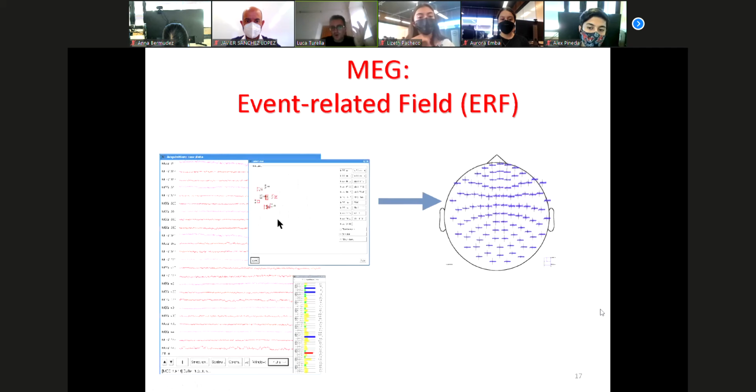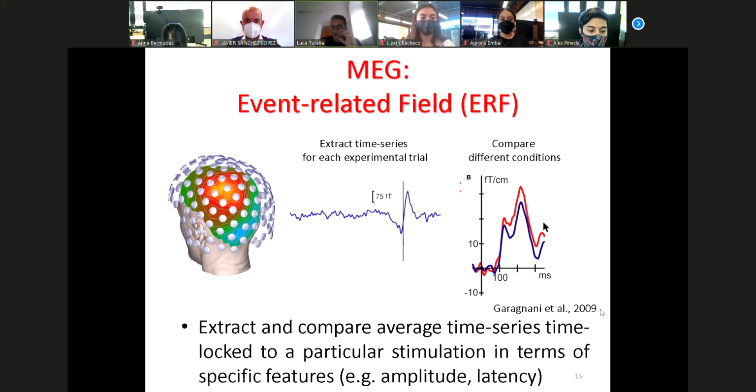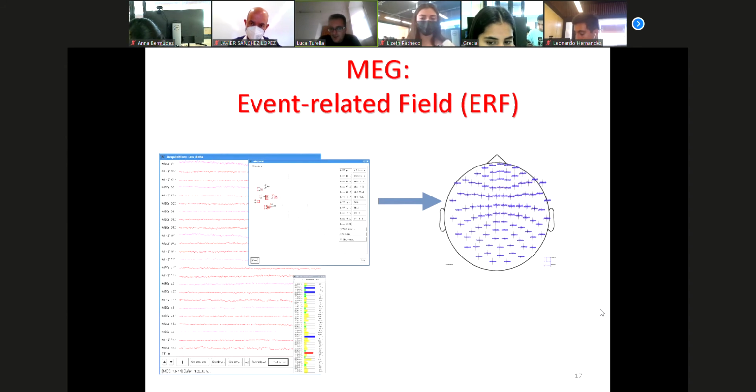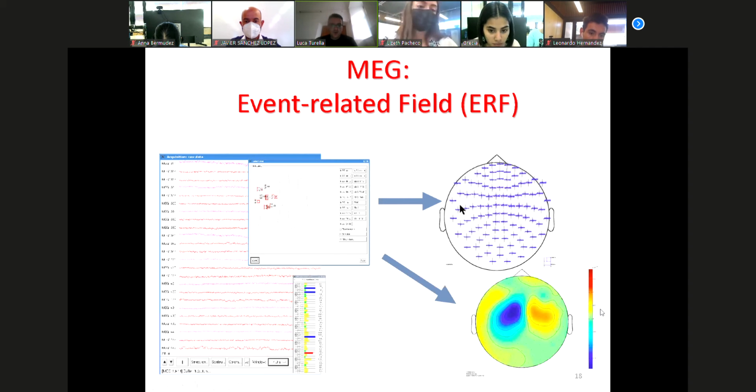See, this is just to show you that clearly here we are considering just one of these 300 sensors, but actually there might be effects that are limited to some specific sensors in the brain, and this makes our analysis much more complicated, because we might also have a specific type of hypothesis related to where in the brain the signal might change. And there's a way of showing this type of modification in terms of topographical maps, showing where the signal might be different with respect to two types of conditions, for example.